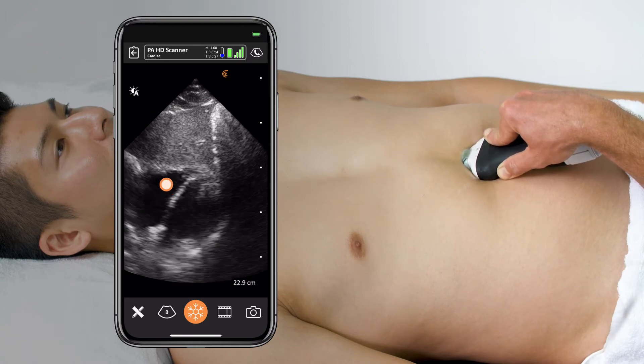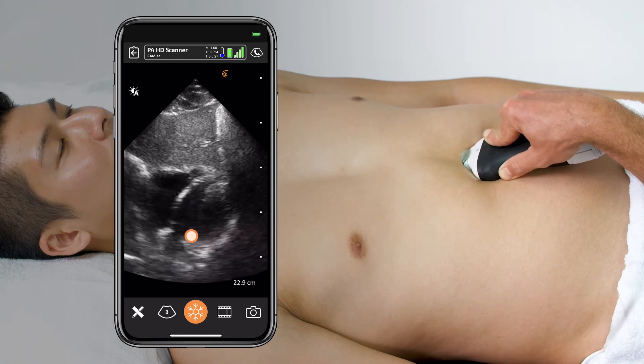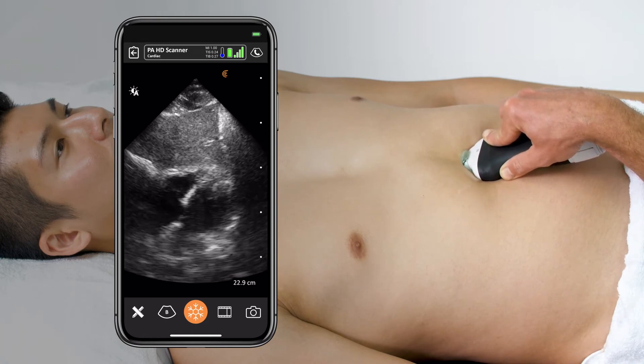Here you can see the liver, the right ventricle, the right atrium, the septum, the left ventricle, and the left atrium in clear view — and there is no fluid around the heart.